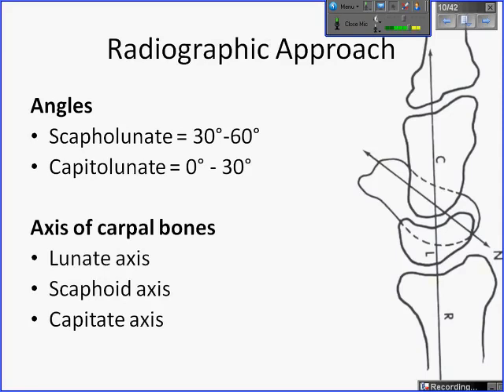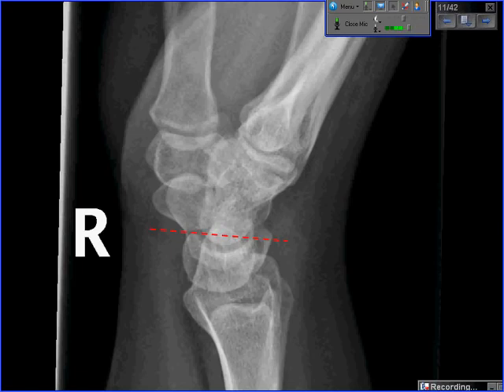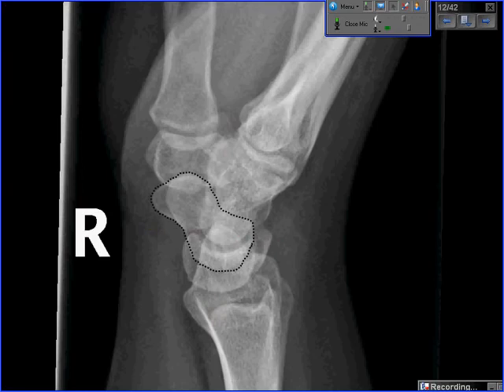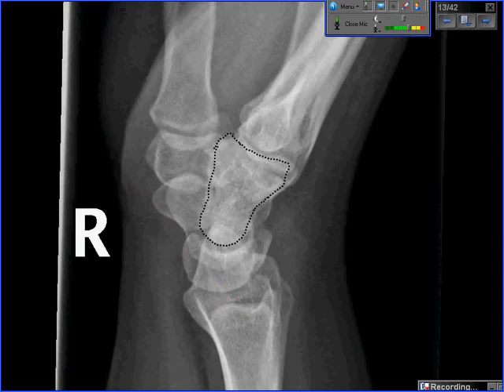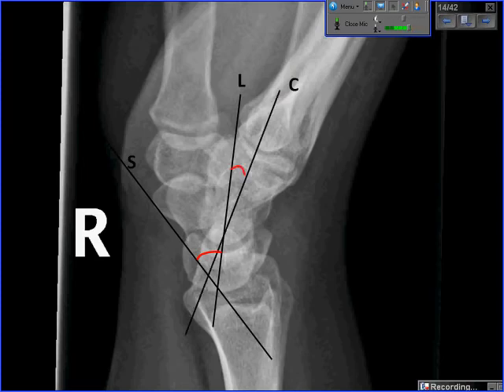Here is a normal lateral radiograph. The lunate axis is perpendicular to a line through its distal poles. The scaphoid axis runs along its volar surface. The capitate axis runs through the body of the capitate. The scapholunate angle is between the scaphoid and lunate axes, and here is the capitolunate angle. Carpal injuries involve high-energy wrist hyperextension, typically in young male patients, from MVCs, sports, or significant falls. They involve severe disruption of soft tissues and are typically treated with open reduction internal fixation.